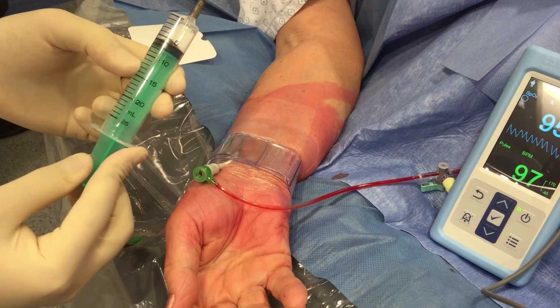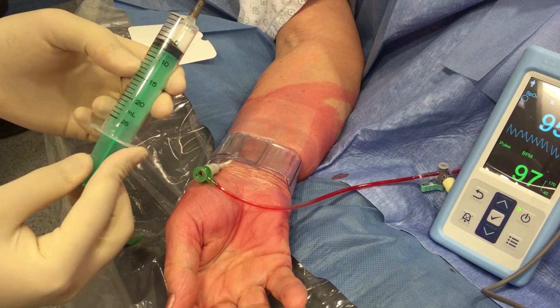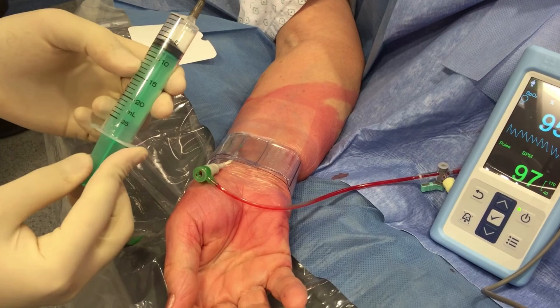You may also use a pulse oximeter to read oxygen saturation. Compress the ulnar artery at the level of the wrist and observe the behavior of the waveform. Keep the plunger in place with your thumb when inflating or deflating the TR band. Releasing the plunger will cause air to expel out of the band too quickly.